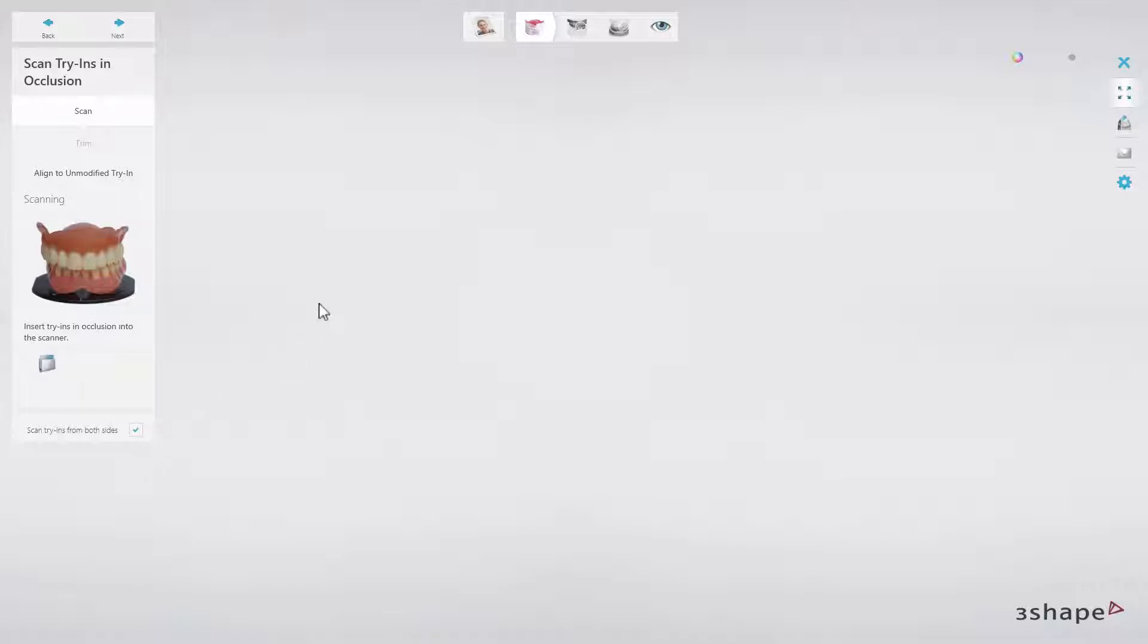The three-step workflow allows you to transfer the modified occlusion and the adjusted shape of the dentures back to the software and align it with the existing designs.